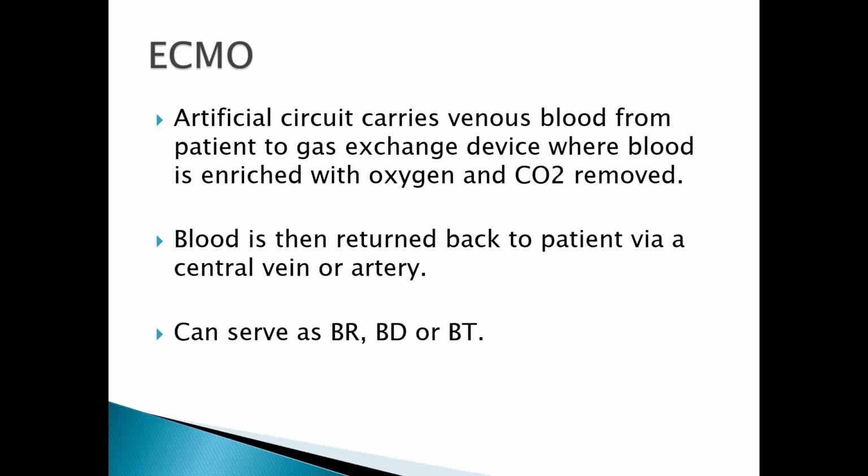And this extracorporeal membrane oxygenation can serve as a bridge to recovery, a bridge to decision, or a bridge to transplantation. Next slide, please.